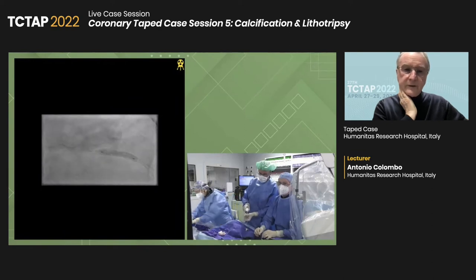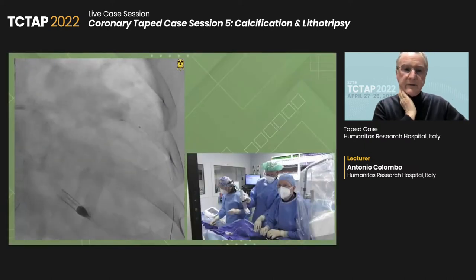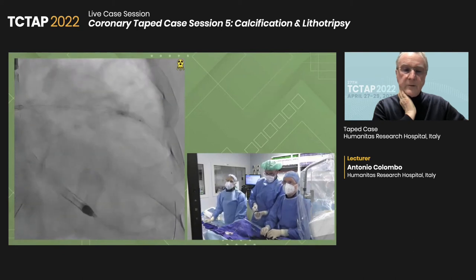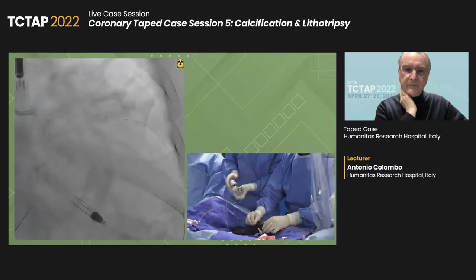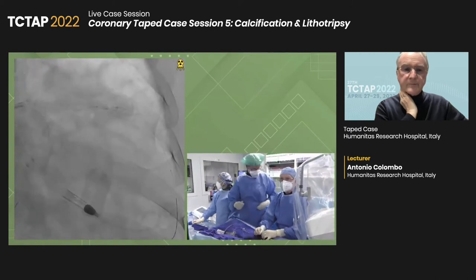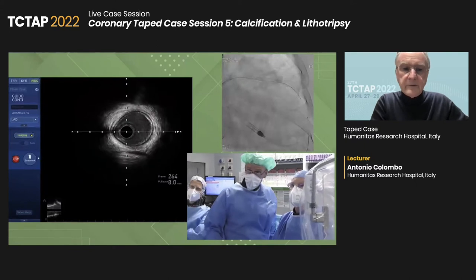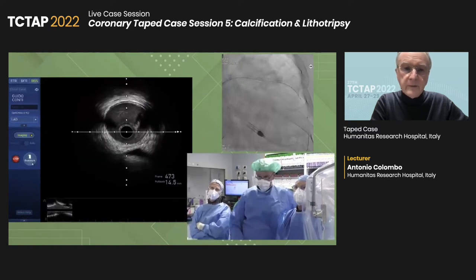You saw a StentBoost to better locate the end of the previous stent. And this is a 3.5, 15 millimeter stent to be added. We almost always post-dilate the stent, even if the lesion has been well prepared. And here we post-dilate at the overlap section. And we repeat an IVUS at the very end, hopefully. You see the distal part of the vessel looks fine. Some calcium here, but the lumen is well preserved.